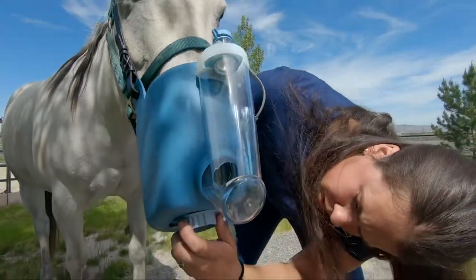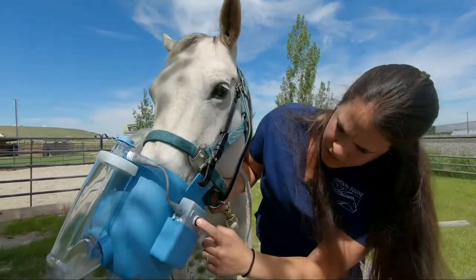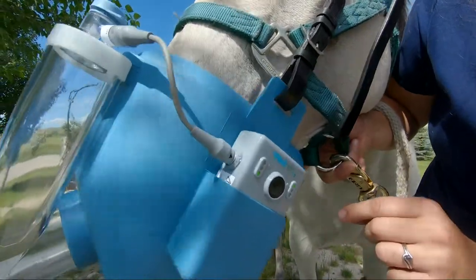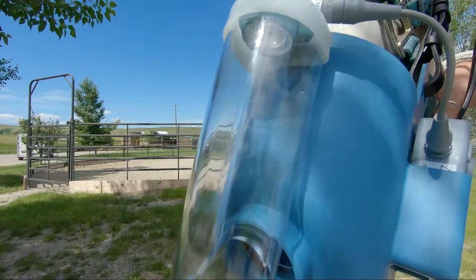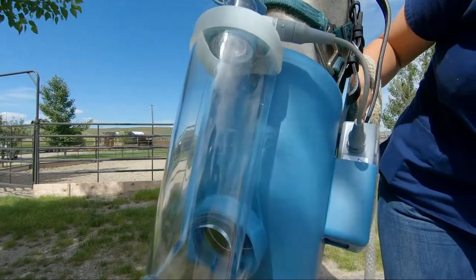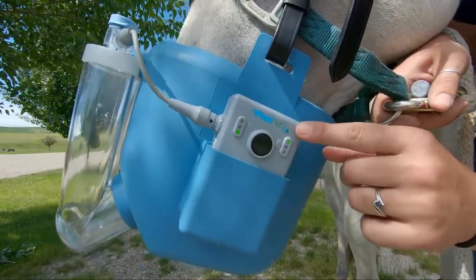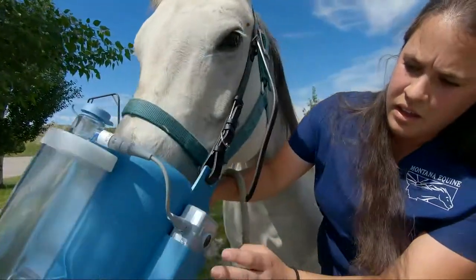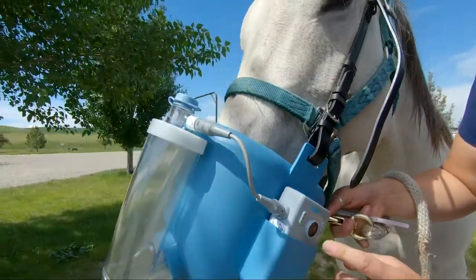You'll then close the bottom of the device, and then you'll turn it on with just one click of the button. You'll see that it's actually starting to nebulize. One thing also is that there are multiple different colors on this — if the battery goes low it will turn red, which is a fair warning that you need to charge up your battery.